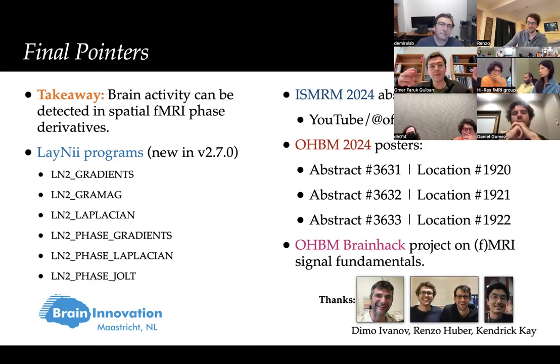You have the ability to detect signal changes in the big veins using the phase data, and since they only come up in the big veins, you can regress it out from your magnitude image and clean it up a little bit. But practically, I don't know how useful it will be for the scales of the vessels at the brainstem and the areas of interest for you. So something to look for in practice. But it might work. Yeah.